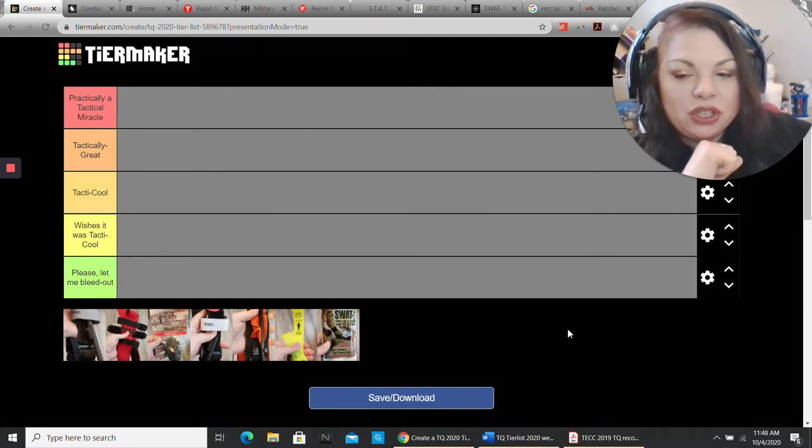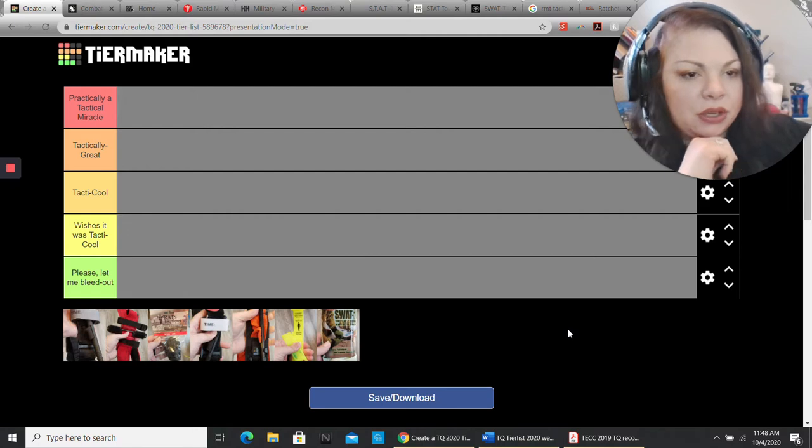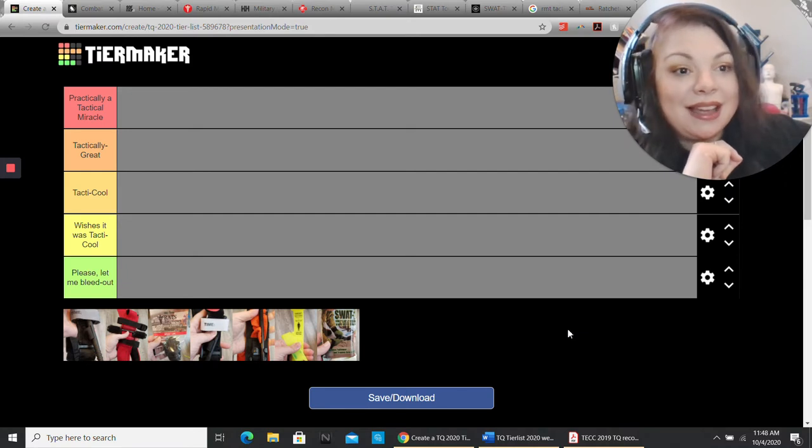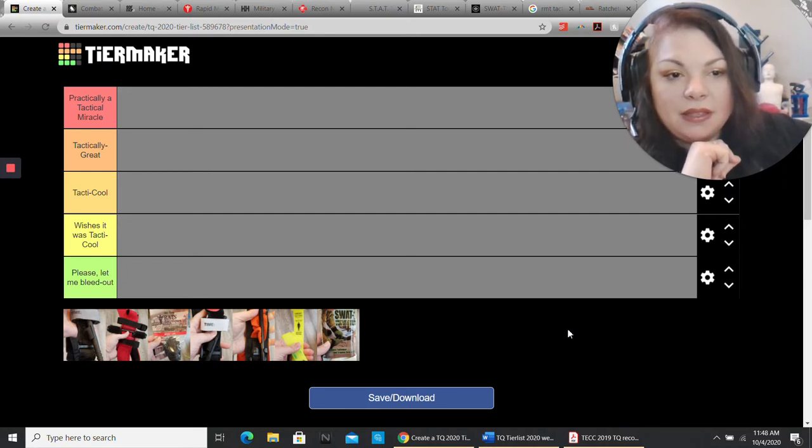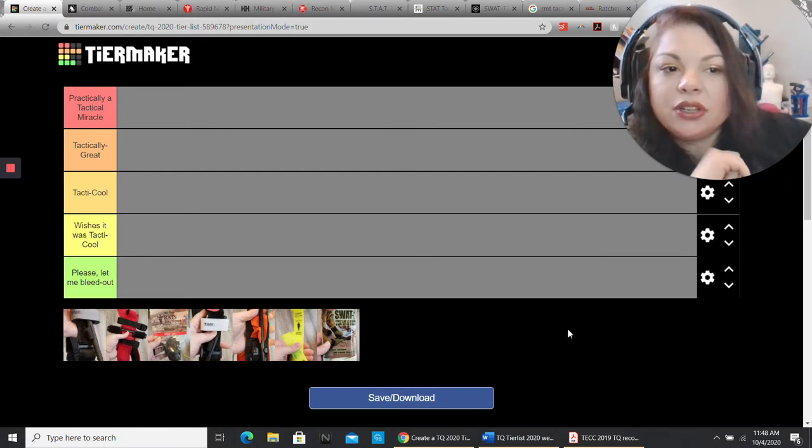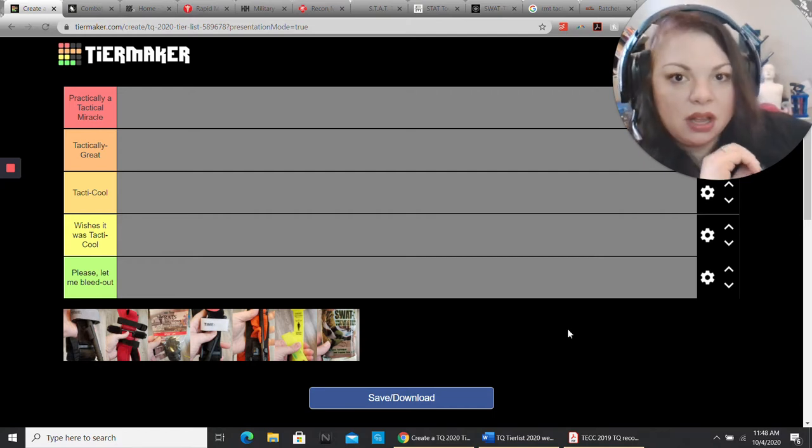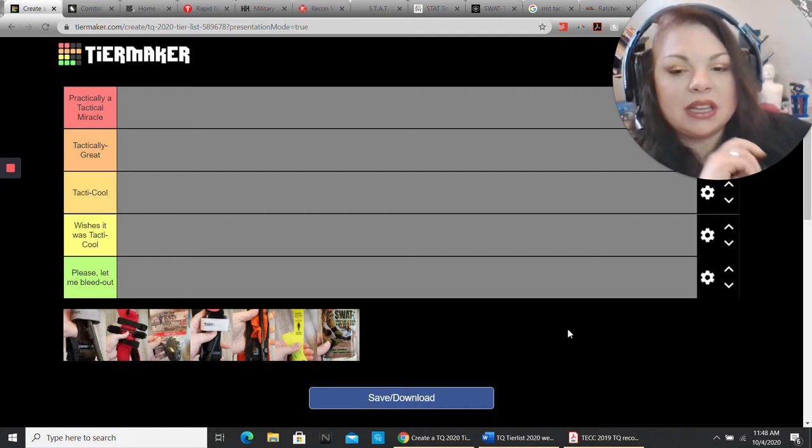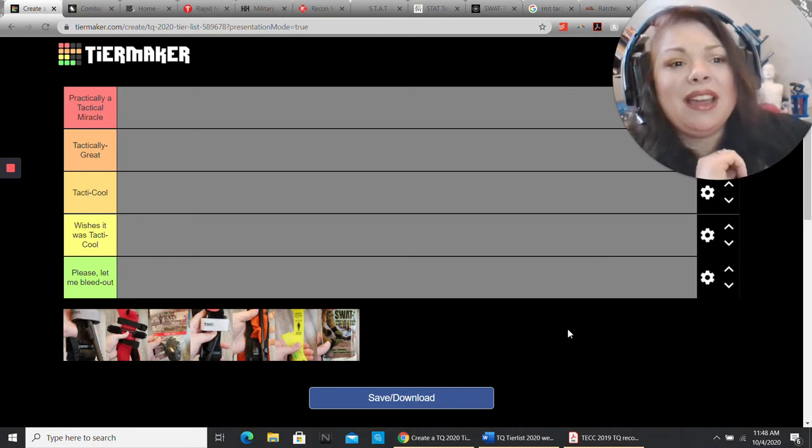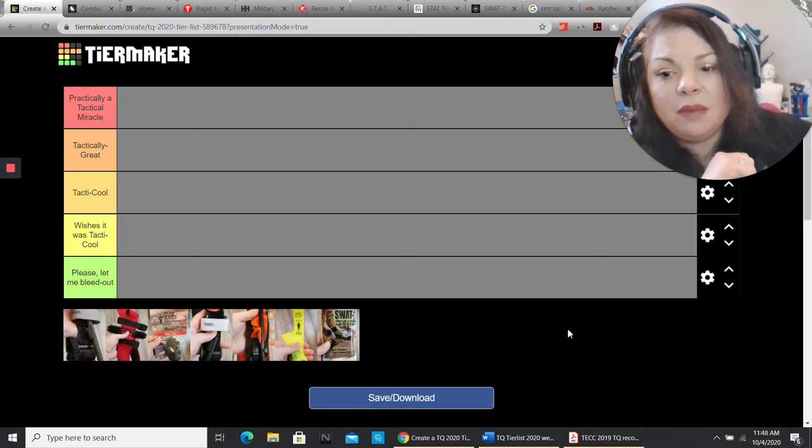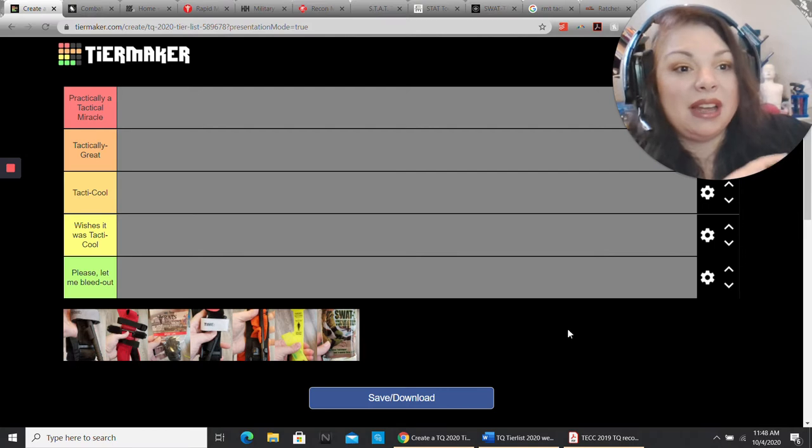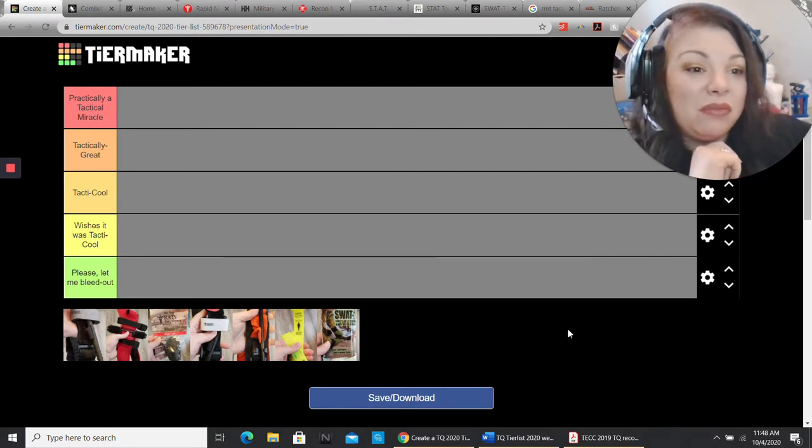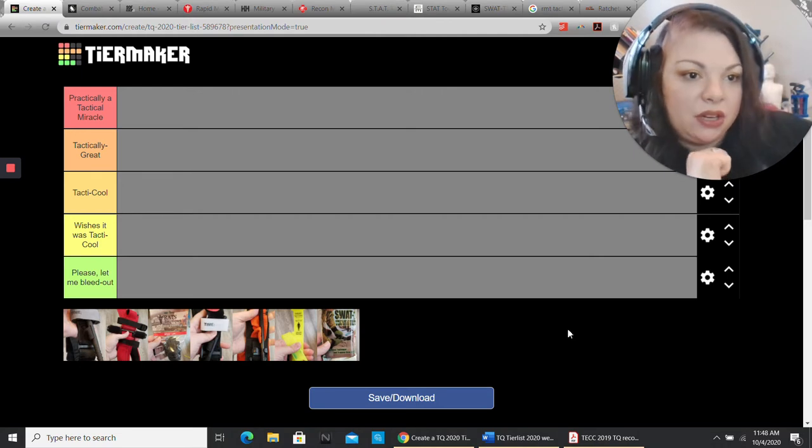Let's go into why I chose these tourniquets. We have the Cat, the Met, the Rats, the Recon, Soft Tee Wide, Stat, and the Swat Tee. The criteria I used was I wanted to use tourniquets that I have had personally a lot of experience with. Tourniquets that I have trained on, trained other people on, and used myself totaling of a minimum of 100 hours.